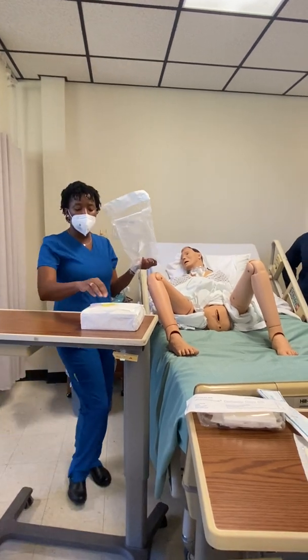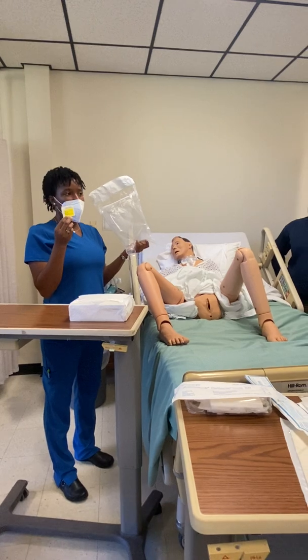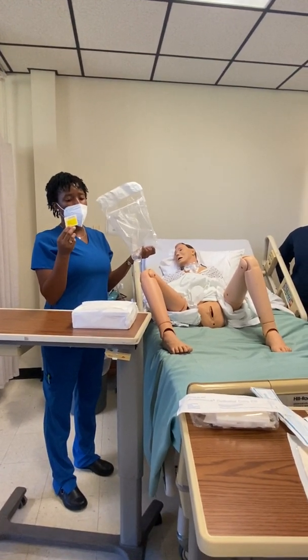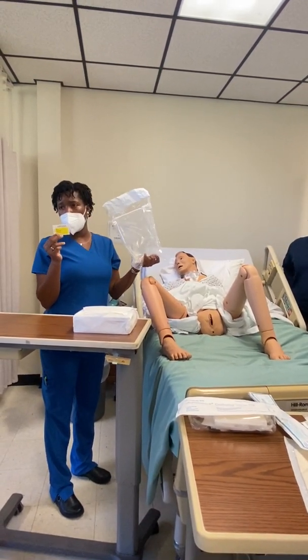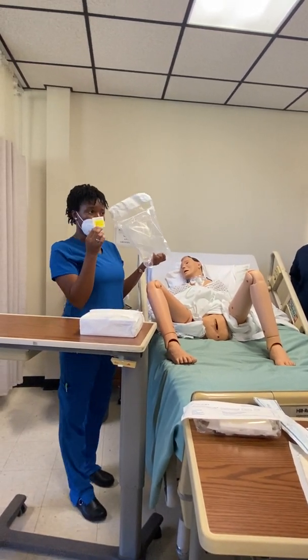There's another little label in here where you can sign that you did it and the date of insertion. A catheter usually stays in for 30 days. Sometimes there are situations where patients might be difficult to catheterize or large, and the doctor may give you a longer order. But you need to put that date of insertion on that catheter bag when you're done.